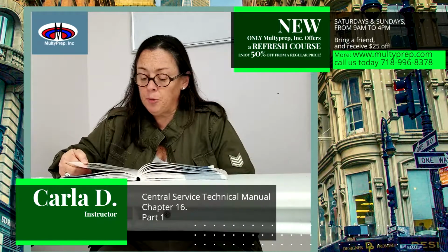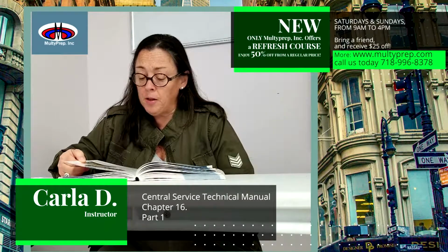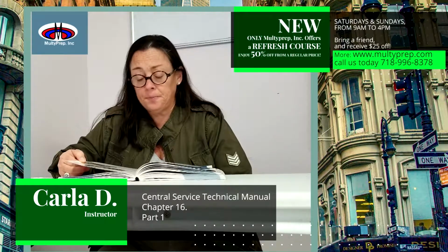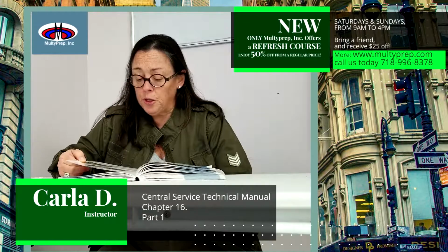Closed shelving is the most preferred type of shelving because it protects the sterile packaging from dust, traffic airflow, as well as other environmental and physical challenges within the storage area. See figure 16.6. Shelves are usually constructed as solid units, allowing for secure storage and easy cleaning.